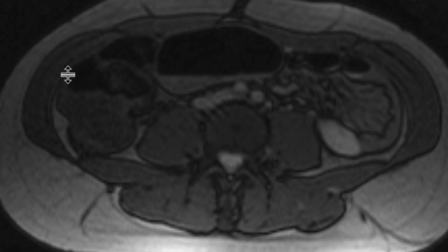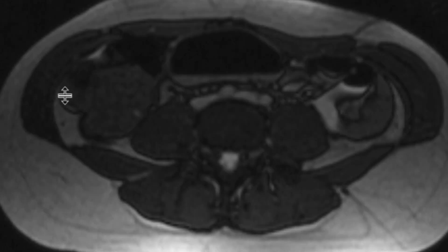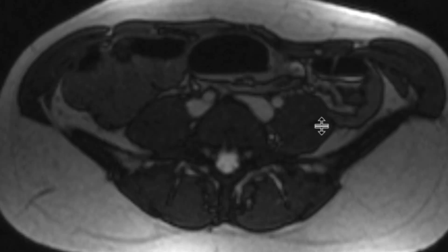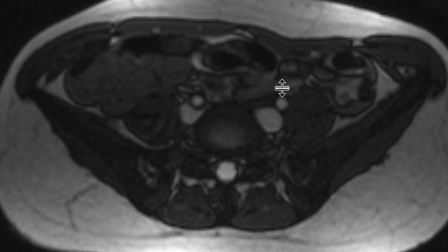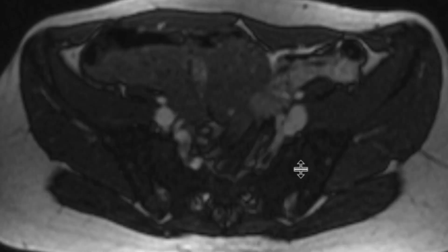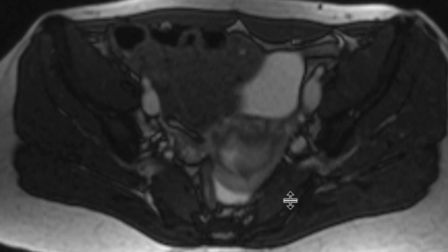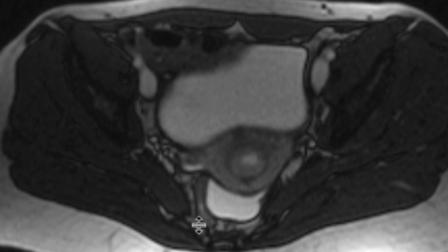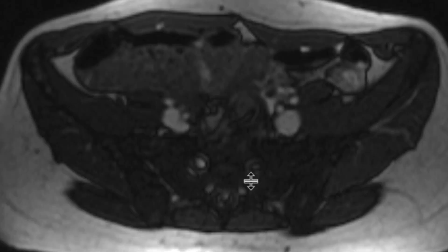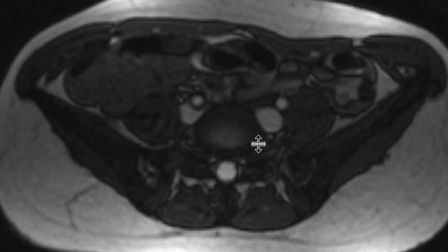These are the pelvic FIESTA images that we also perform in these patients. This is the sigmoid colon distended. Following the tip of it, you can start to see that twist, and as it goes down more inferiorly, the colon is collapsed over there.